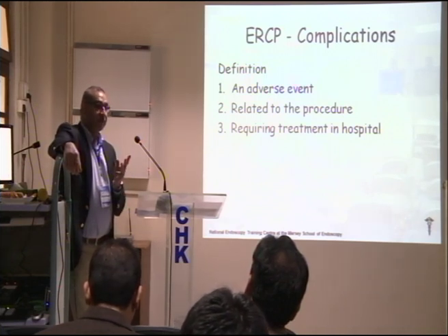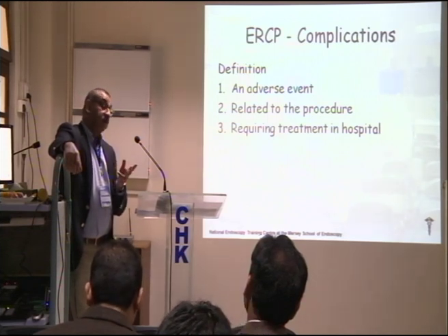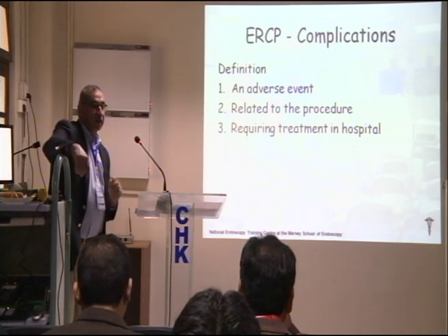severe bleeding, in which multiple transfusions were used. Eventually, we had to use embolization in one of them. The other one stopped spontaneously, and the third wasn't so bad. So severe cases are very rare.